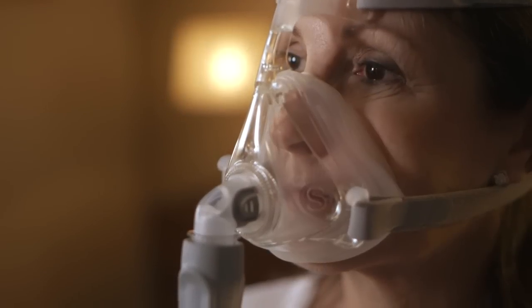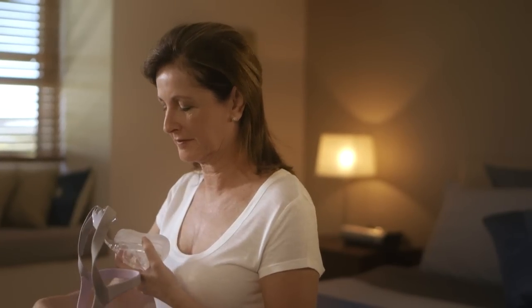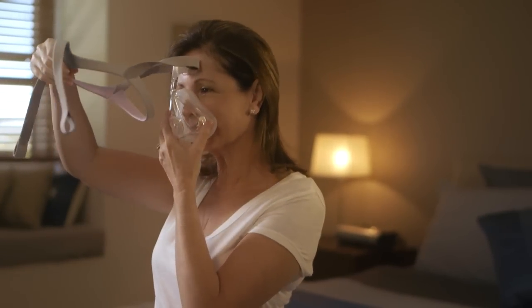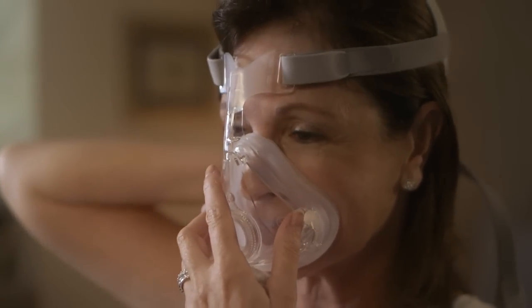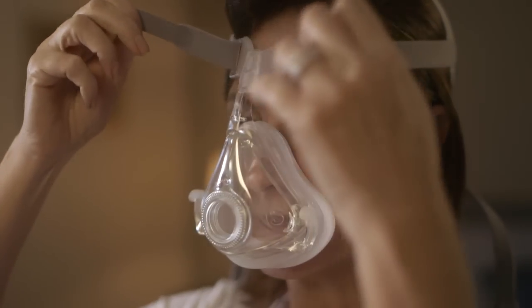It could also be that the cushion membrane is creased or has folded over. Refit your mask, ensuring you hold the cushion correctly on your face before pulling the headgear over your head. Don't slide the mask down your face during fitting, as this may lead to folding or curling of the cushion.